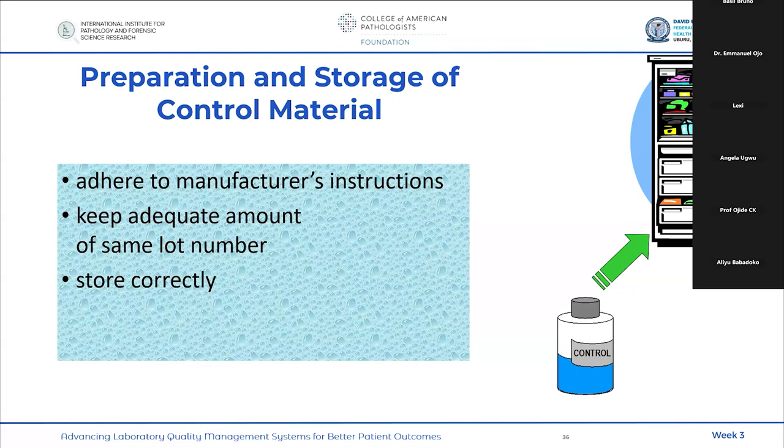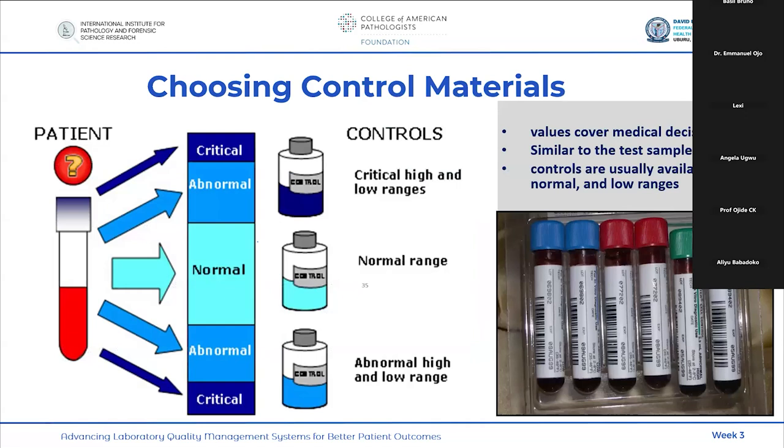And the expectation really then was you bring out your quality control sample from the fridge and you allow it to attain room temperature to stabilize by itself. So the efforts to try to bring the quality control material to room temperature, bypassing the normal procedure of putting it on the bench to stabilize by itself, was the type that, the control vials, I think I remember correctly, there are control vials like this.